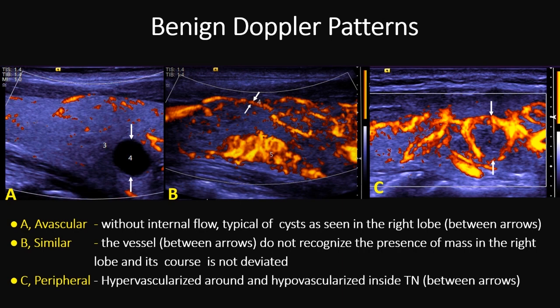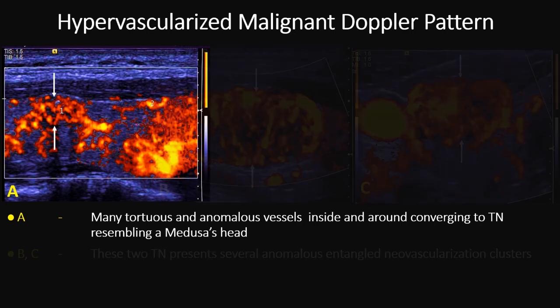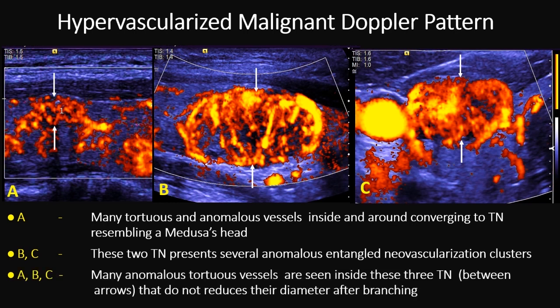Here we have three different hypervascularized malignant Doppler patterns. In this lesion, shown between arrows, we can see many tortuous vessels and many vessels converging to the lesion — very typical of malignancy, resembling a medusa's head. In these two other lesions, the most important features are these anomalous entangled neovascularization clusters and many tortuous, very small vessels, as if fragmented in many places. Also, vessels do not reduce in diameter after branching.